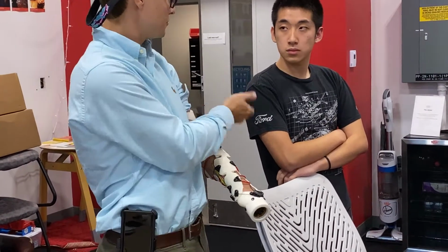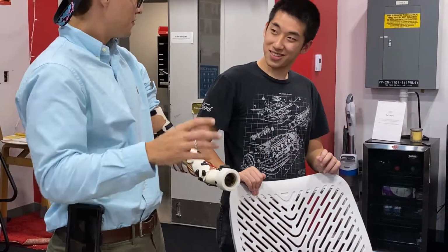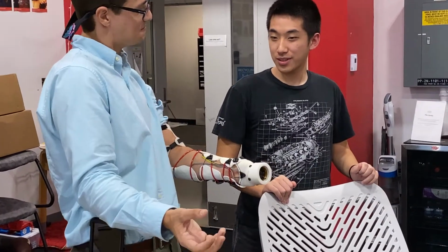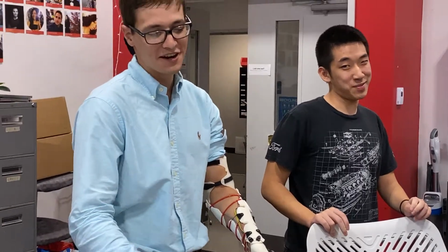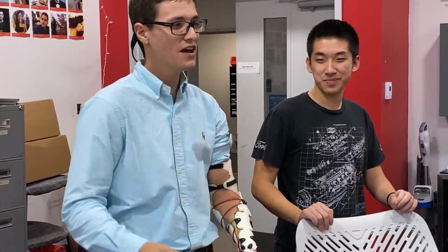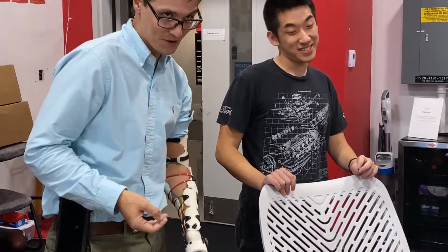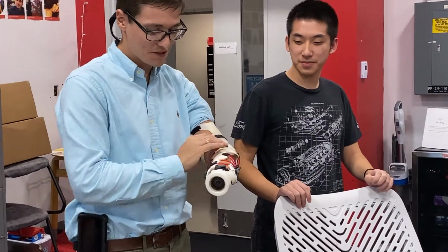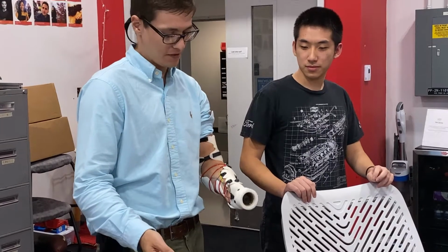And then you want to talk about the co-contractions? Like what you're doing with the co-contraction. So how do we make more degrees of freedom? Another question we're asking is, how can we make degrees of freedom that don't exist? How can we do that? One of Marty's works that he is working on is providing those degrees of freedom.